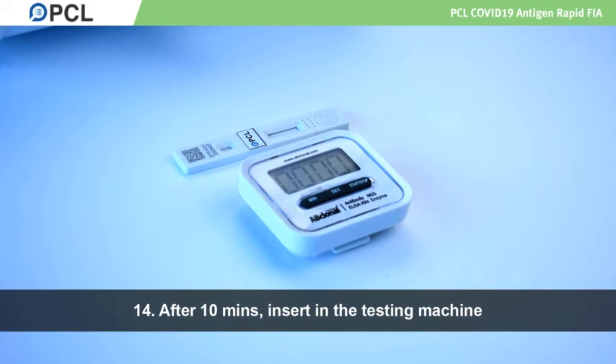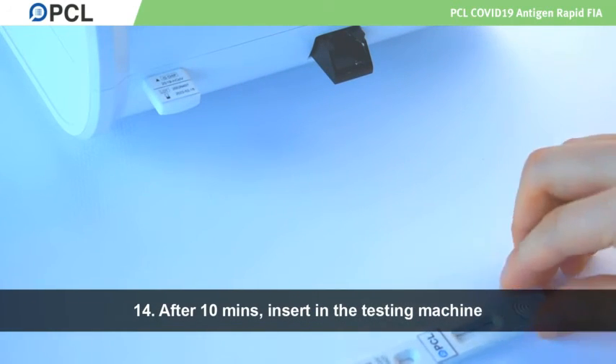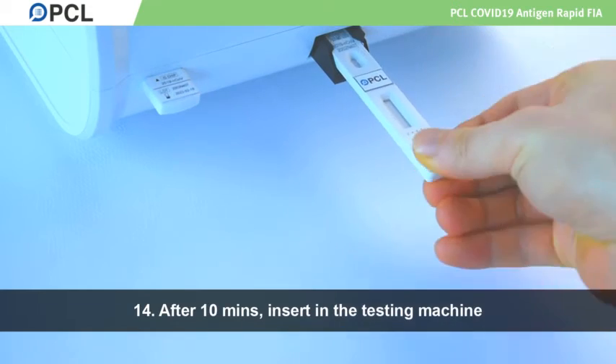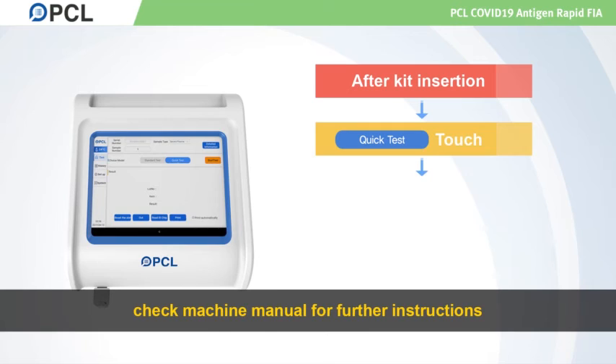Wait ten minutes and insert the testing kit into the testing machine. Check the machine manual for further instruction.